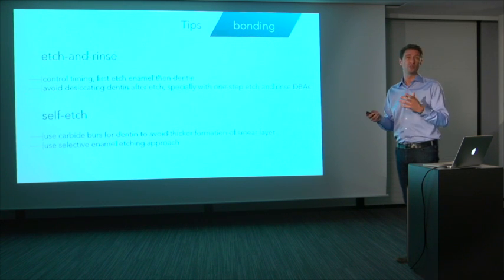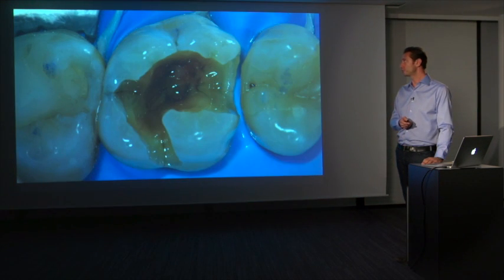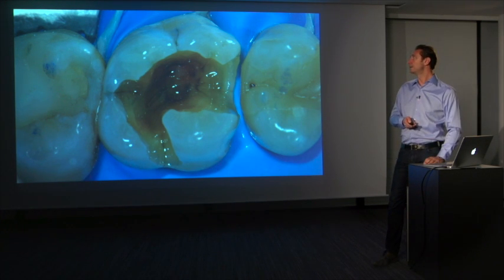So we're bonding to two different substrates, so try to be as predictable as possible on those two. This is how it looks after the bonding procedure.